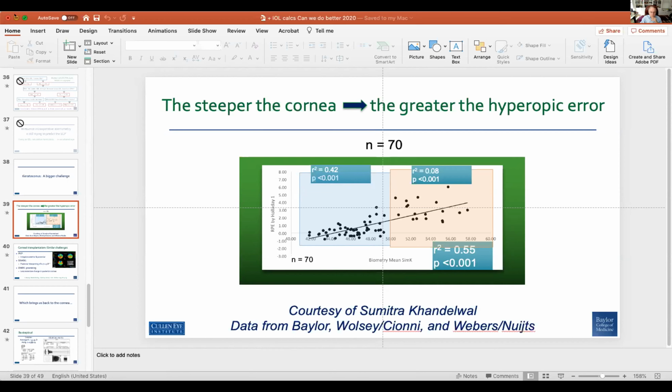astigmatism. And this is a very common question among ophthalmologists. My question is, can tilt cause coma? And can decentration cause astigmatism in an IOL? Tilt definitely causes some coma, and decentration can also induce both coma and some astigmatism. Not a lot of astigmatism, but it definitely induces coma. Again, those are sort of arguments for using IOLs with zero asphericity, because IOLs with zero asphericity, as it turns out, have their quality of vision less affected by either tilt or decentration.